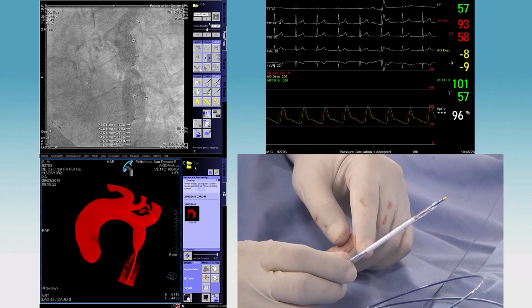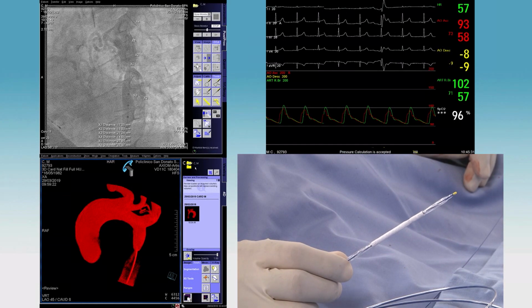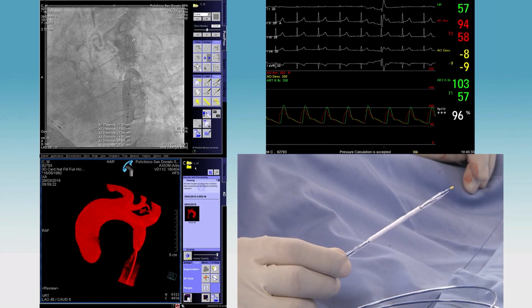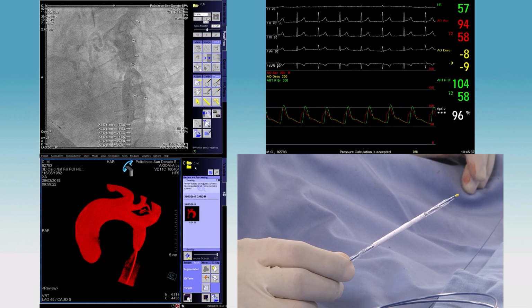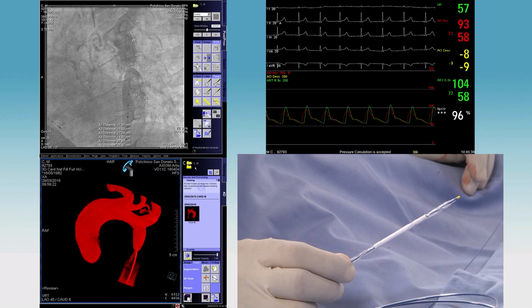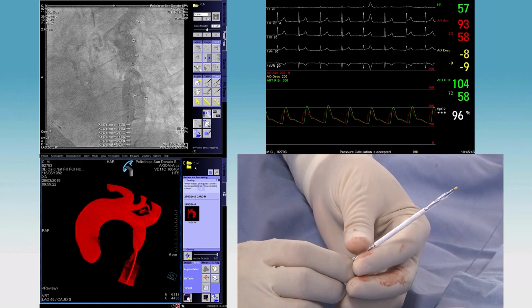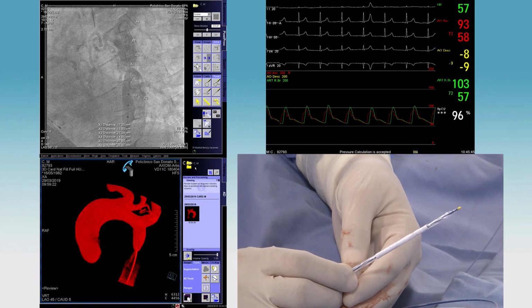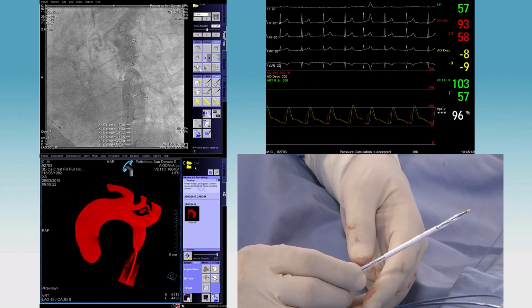And there are two markers there on the balloon, so the stent is nicely in position. So is this covered on both sides or just the outside? The stent's metal is cobalt chromium, and the covering is PTFE, and that's on the outside.